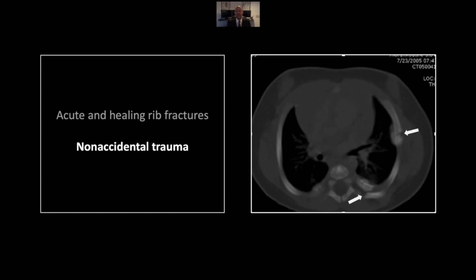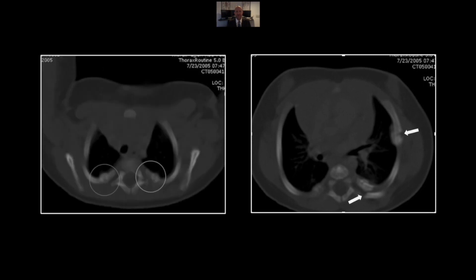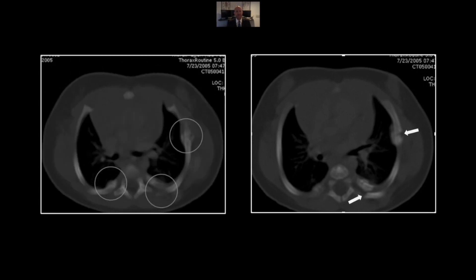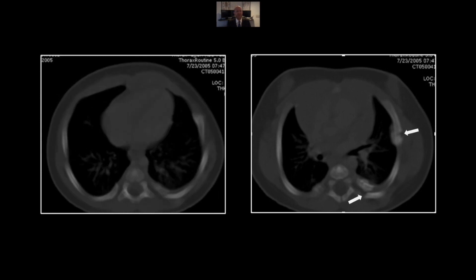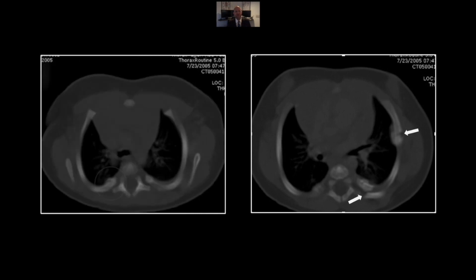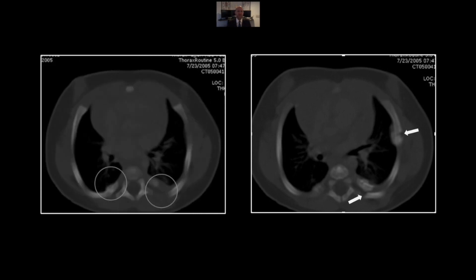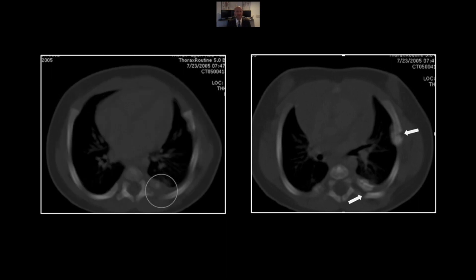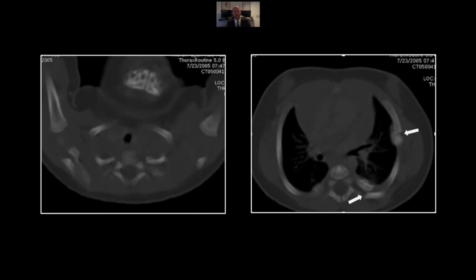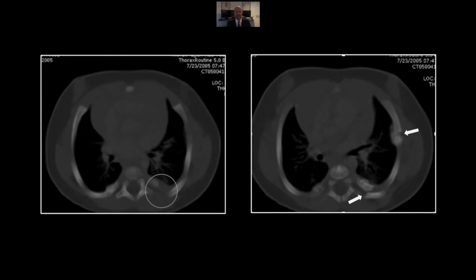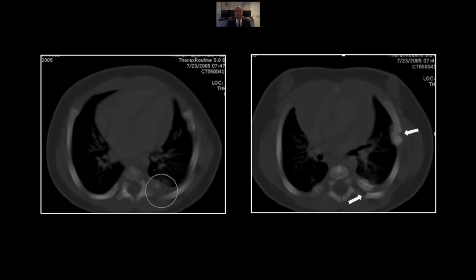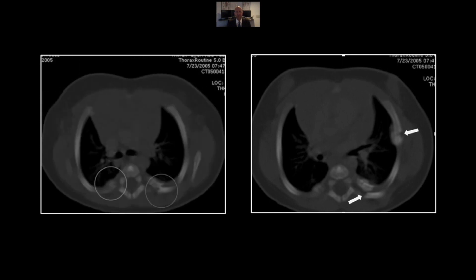Posteriorly, there are overlapping acute fractures adjacent to a different healing fracture as well. The posterior fractures are particularly prevalent and are present at almost every upper thoracic level. That exuberant callus in the left lateral rib is pretty telling as well. So that is a definite case of non-accidental trauma, the reporting of which is of course required in most states.